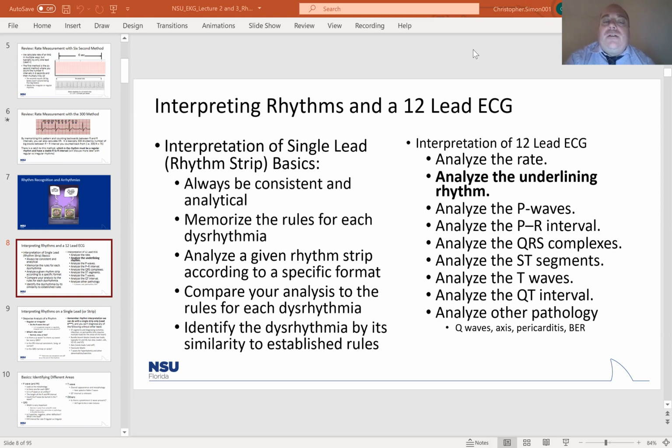But we're just going to freestyle it a little bit on the whiteboard, and we're going to draw out all of the rhythms, and we're going to identify the aspects of the rhythm and what makes it the rhythm. If you've already committed the rhythm criteria to your head, then that's fantastic. This will go a little bit easier for you, but if you haven't, then maybe just have it close by so you can reference it while we're doing this.